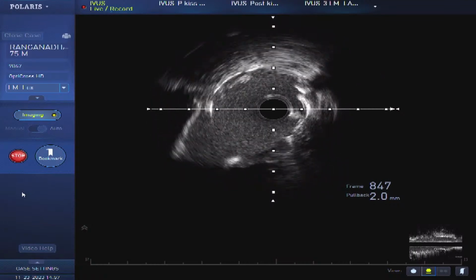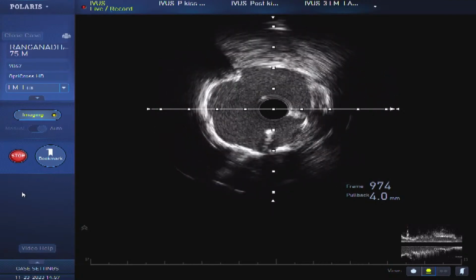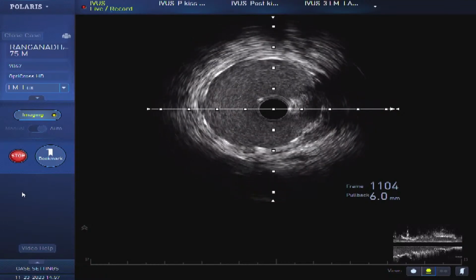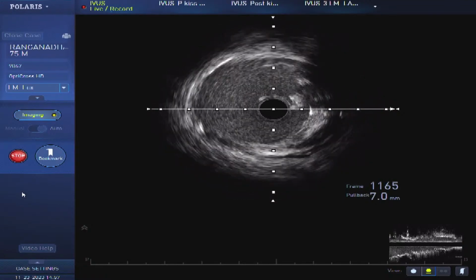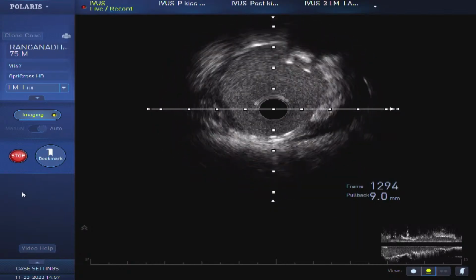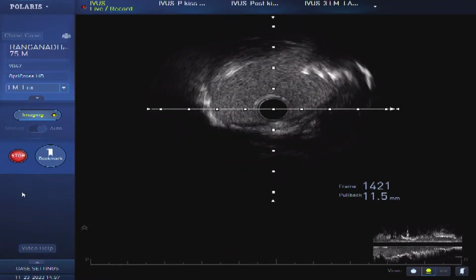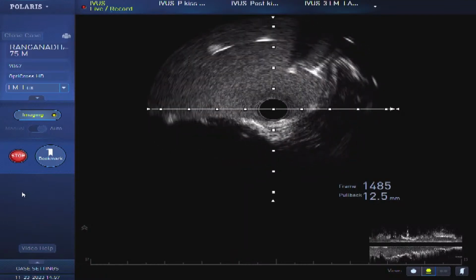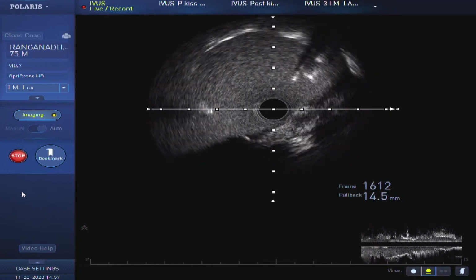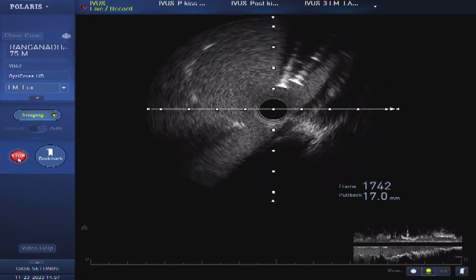That is the eccentric. Oh, beautiful. Now see, beautifully expanded. That distal left main osteum calcium also nicely expanded. I will come to the osteum. I will disengage. See now, that stent is there, expanded into the aorta, slightly extended to the aorta. That's fine. ఐఎమ్ రిమూవింగ్ బోత్ బ్రదర్.